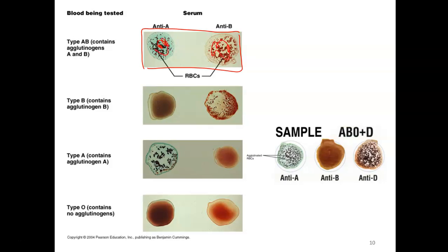And if agglutination occurs, the way to tell is if you look at the blood on the slide.